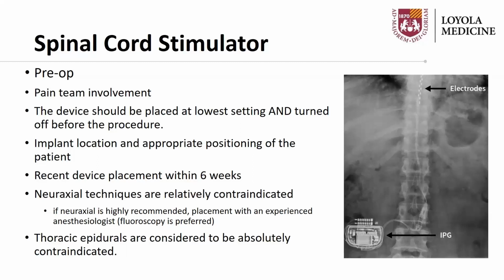And you see a radiographic image here of the pulse generator, and you can actually see the radio-opaque electrodes in the patient's epidural space.